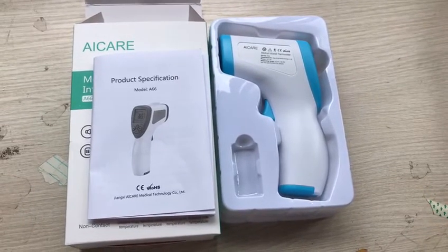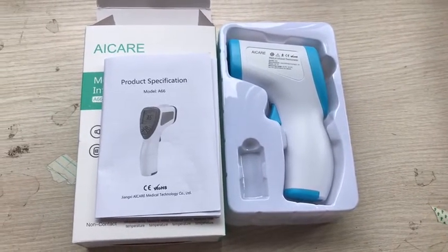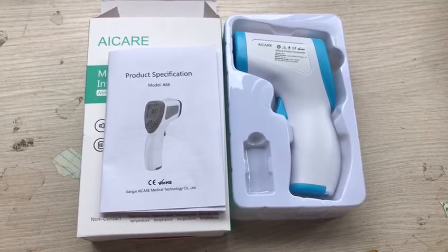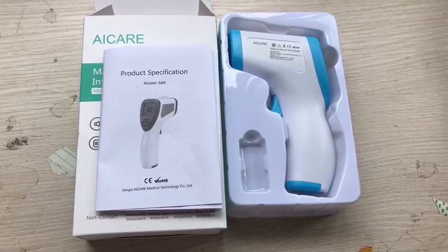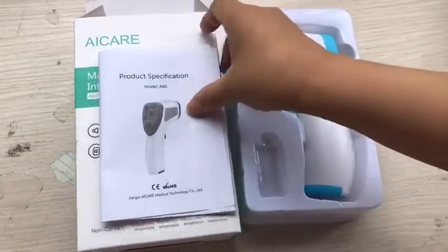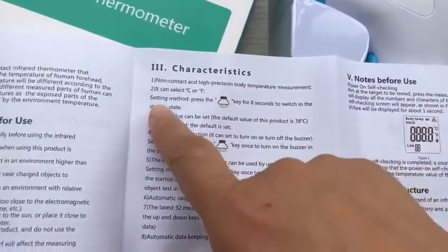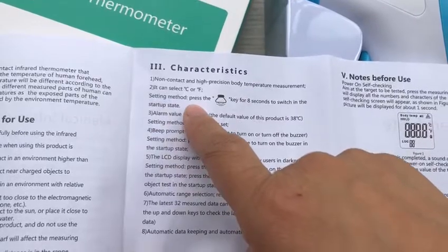Today we are going to tell you how to convert Celsius to Fahrenheit about our product the thermometer. Here is the user menu. As you can see in the characteristics, we show the setting mode.